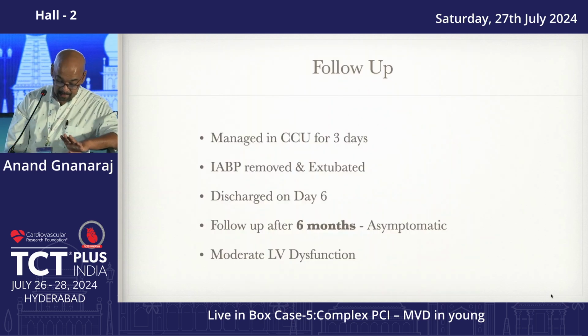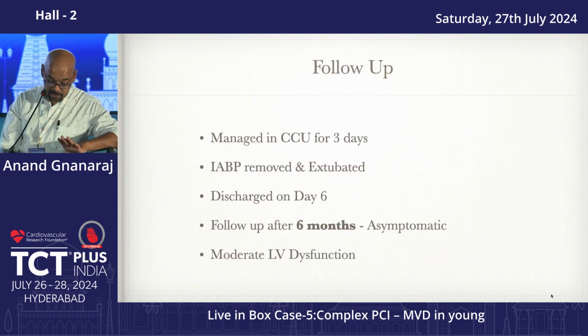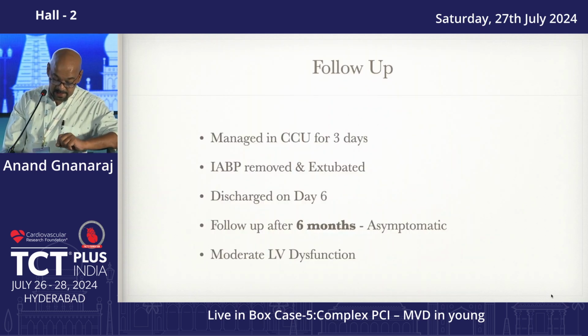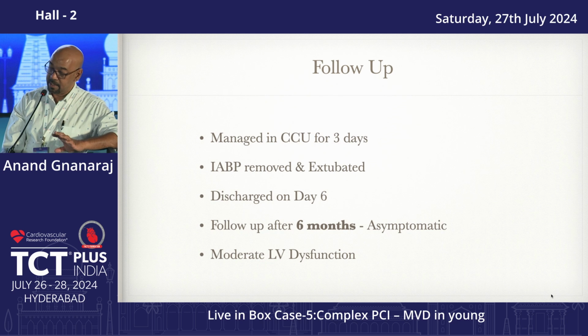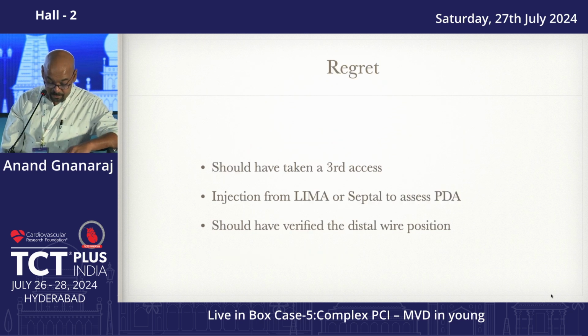He was managed in the ICU for 3 days, discharged on day 6. He is still on follow-up actually. At 6 months, his LV had improved, no heart failure. So I should have taken a third access or at least a LIMA injection, before pushing the microcatheter.